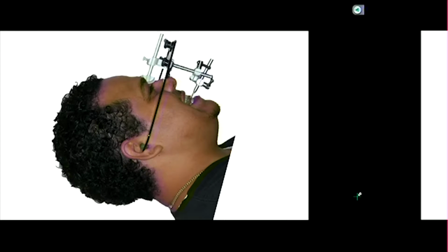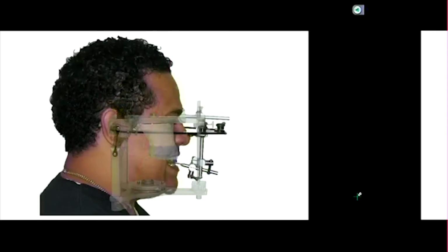Okay. All right, what's next? So you can see we'll put the face bow onto the articulator, and that's how it fits together, exactly how I have it here. The top member will hit this little metal plate, and then you can imagine putting a cast onto this articulator, or onto your bite fork where you made the bite record, and then you fill the rest of that with plaster, like we've done here. Okay?